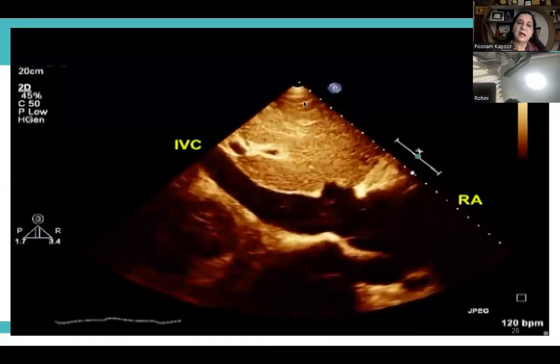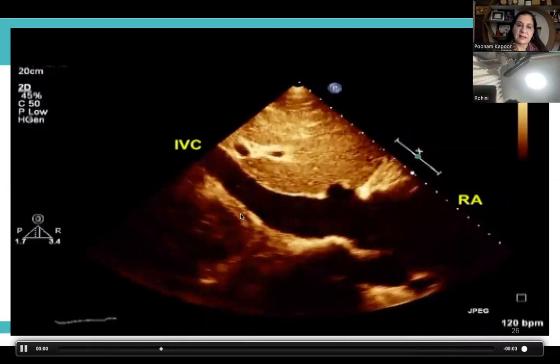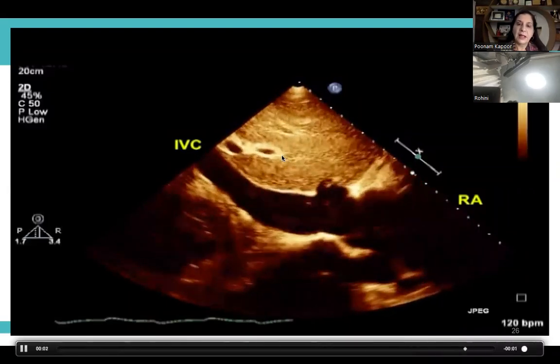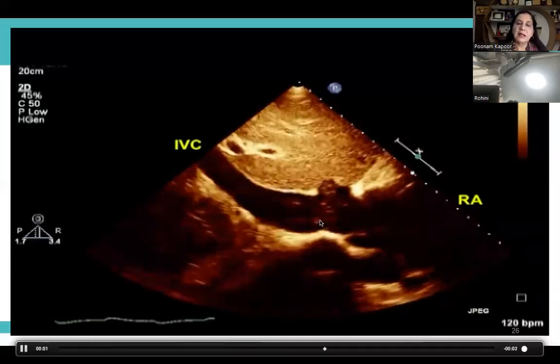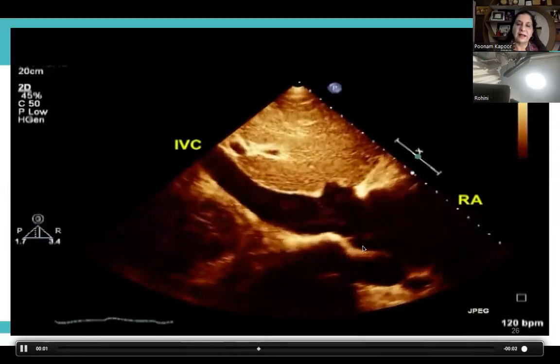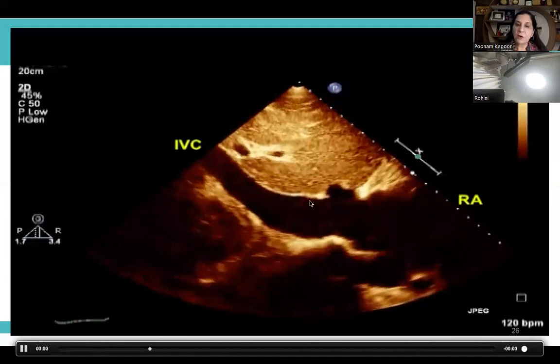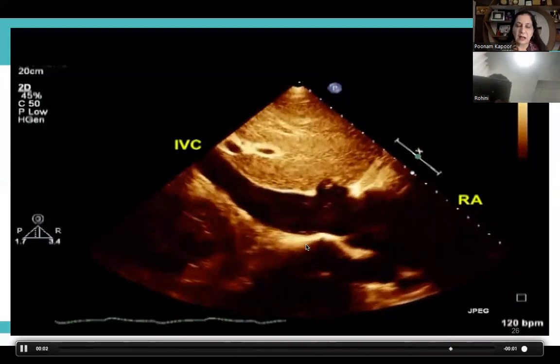You can see the pericardium. As the IVC enters the RA, the IVC is dilated, more than 2 centimeters. The hepatic sinusoids are all engorged. And when we did a Doppler flow across this and measured how it is entering the RA, this typical engorged IVC known as IVC plethora is again a hallmark of constrictive pericarditis.